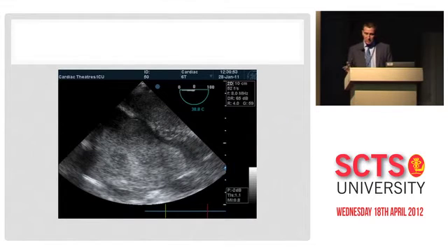So here's the next in the sequence. No, the patient didn't arrest. That was actually on bypass. But you wonder, looking at the size of it, how they didn't have an arrest.